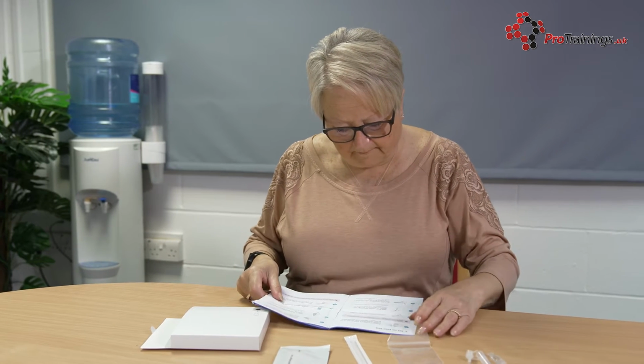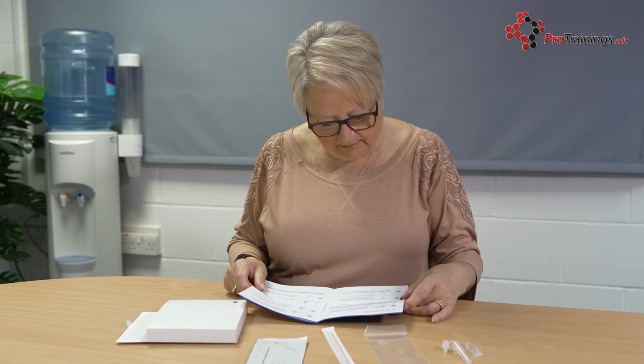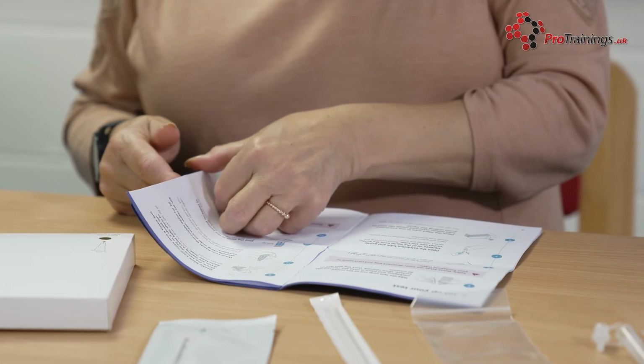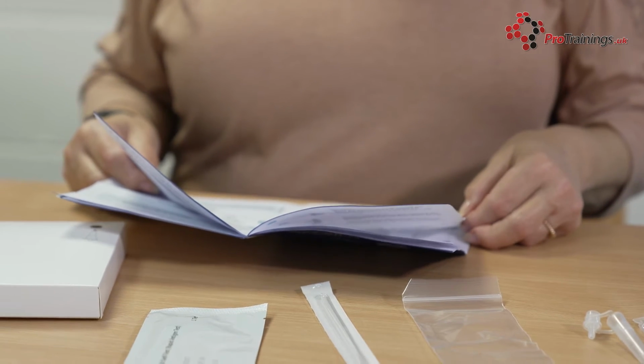You should not eat or drink for at least 30 minutes before taking the test to avoid the risk of spoiling the results. If you have problems in your vision, it's best to have someone there to help you read the results. And if you have problems with your hands, you may need someone to help you take the test. If for any reason you cannot take the throat swab, for example if you have a tracheostomy, swab both nostrils.